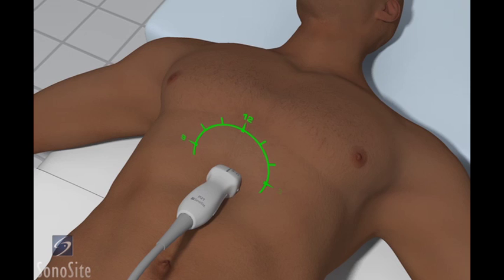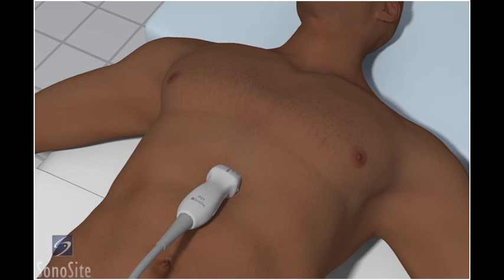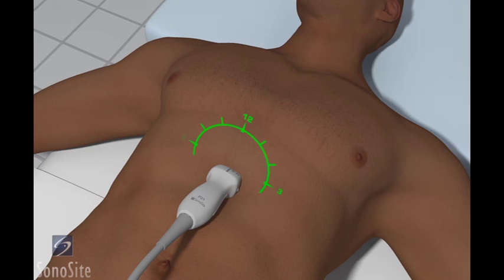As an alternative approach, this exam may be performed using an abdomen exam type with the orientation marker to the patient's right side at the 9 o'clock position.